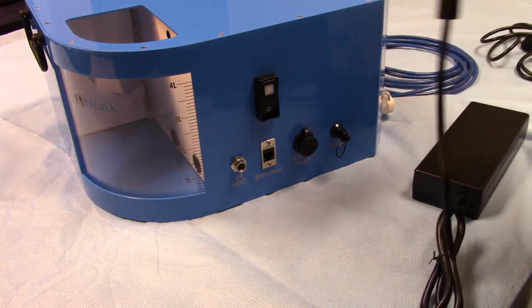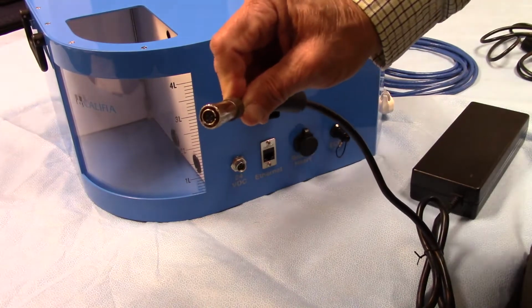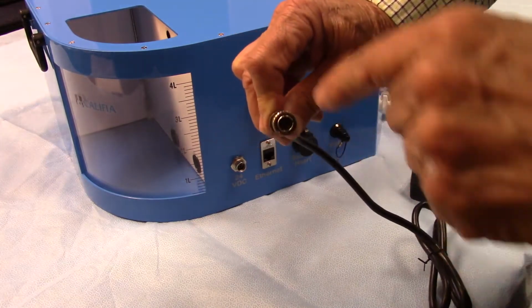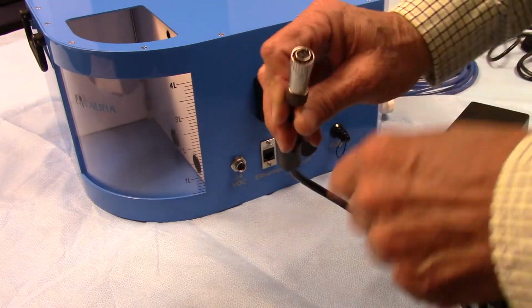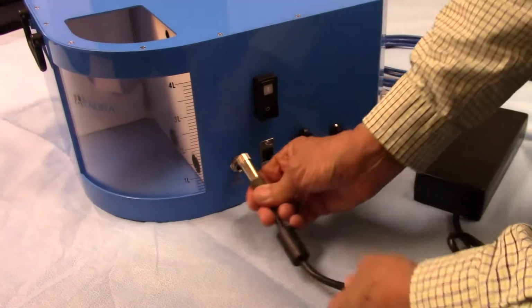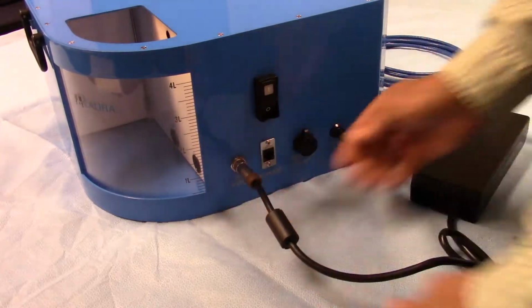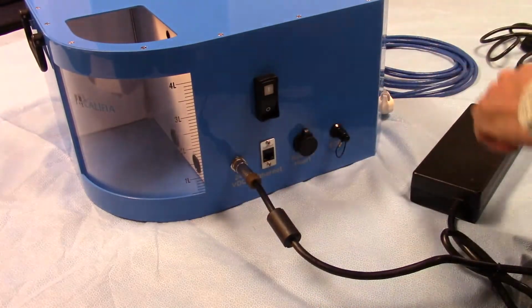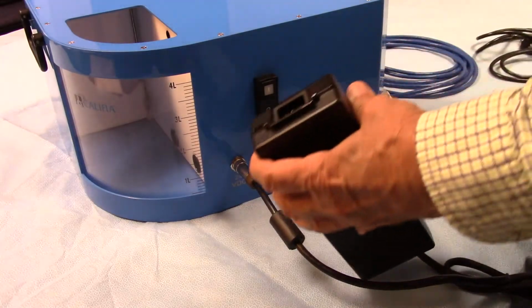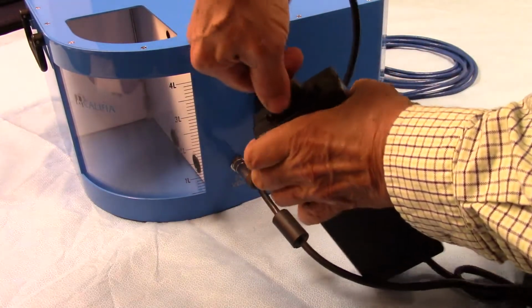The first step in setting up Califia is to attach the power supply. You'll notice that the connector has a little notch in it, and that goes down. The receptacle has the part that plugs right in there, and you give it a slight turn. The other thing is the power supply has its own power cord that needs to be attached.